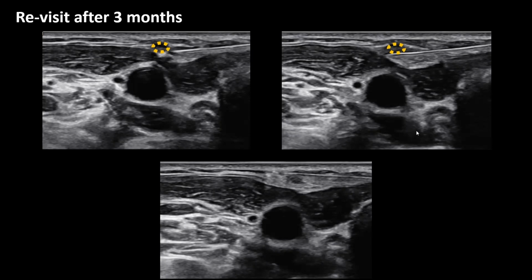In order to prevent skin burns and damage to the surrounding structures, hydrodissection with cold fluid was done around the recurrent cancer. This photo shows a hydrodissection in which a needle is performed in front of the lesion. There were no skin burns or any issues following the radiofrequency ablation.